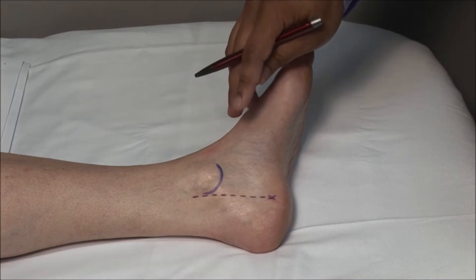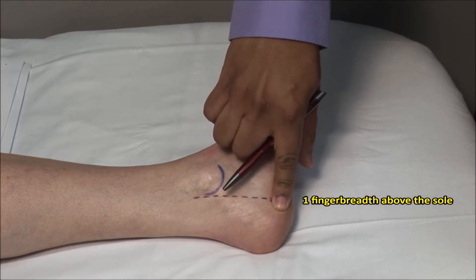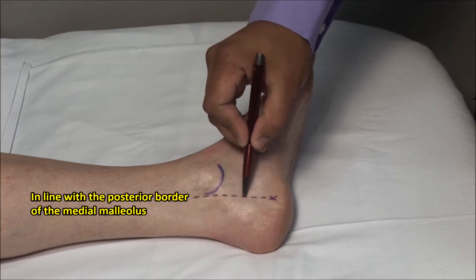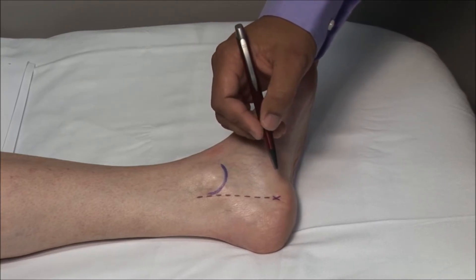The point of injection is about one fingerbreadth above the sole of the foot, on an inner line that corresponds to the posterior border of the medial malleolus. Using a retractable pen, mark the point for injection.